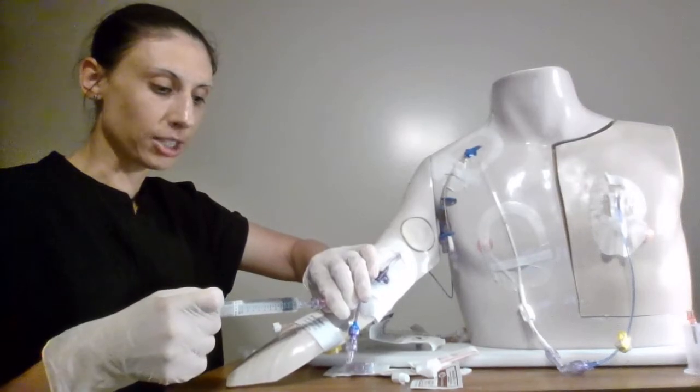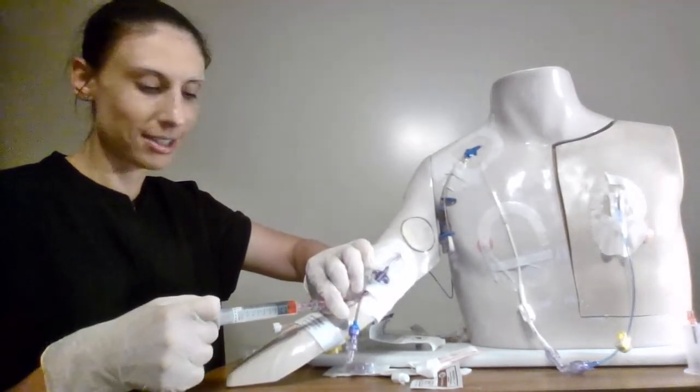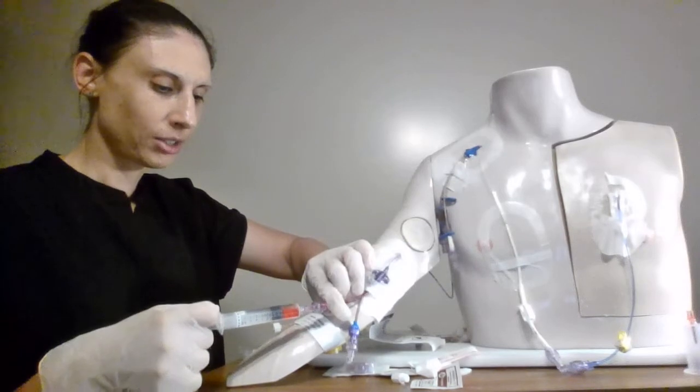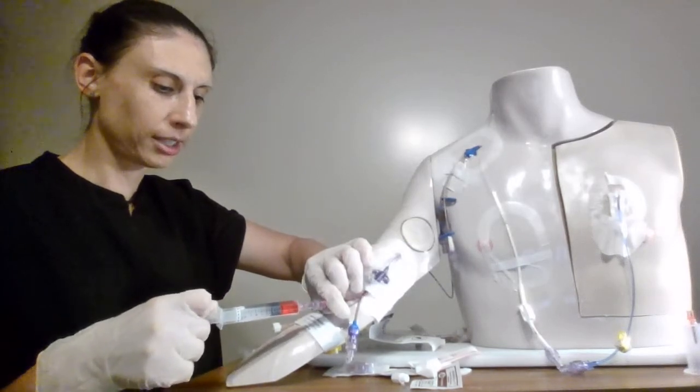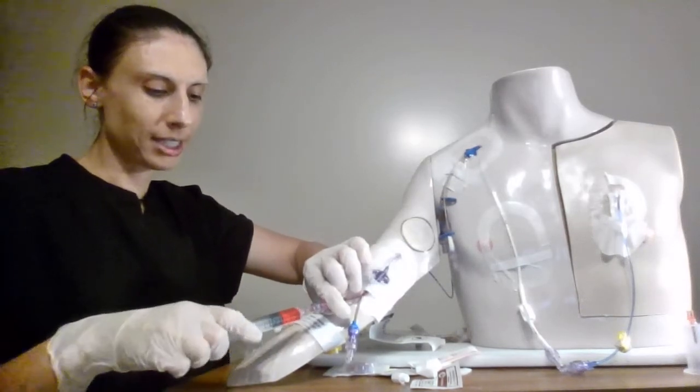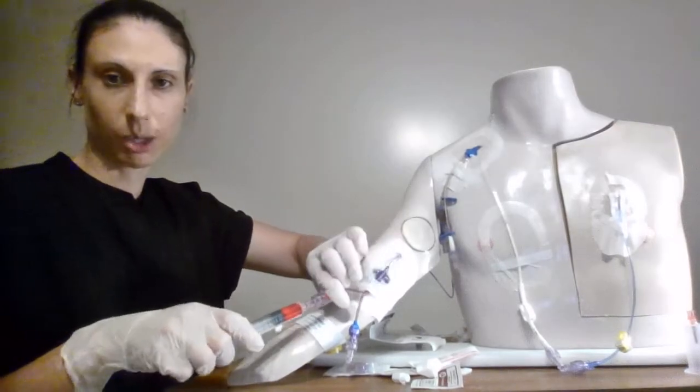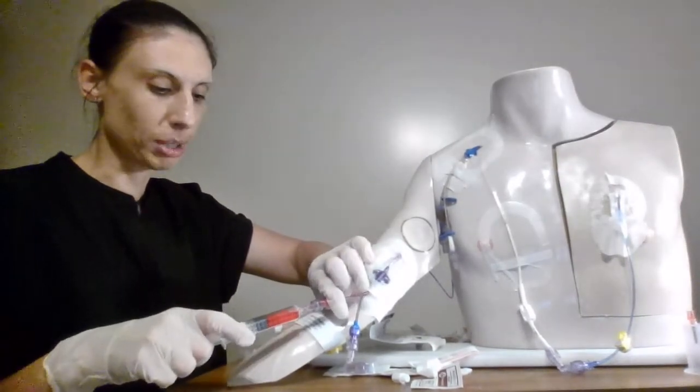Now what's really handy too is I can aspirate my discard right into the same syringe. So I'm going to pull back. So what I'm pulling back is now just that normal saline that was sitting in the line and you can see some of my patient's blood.